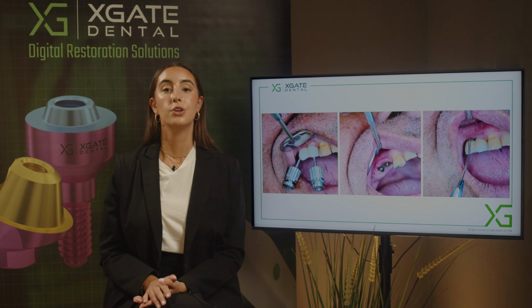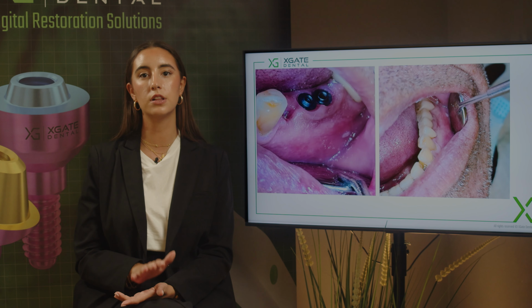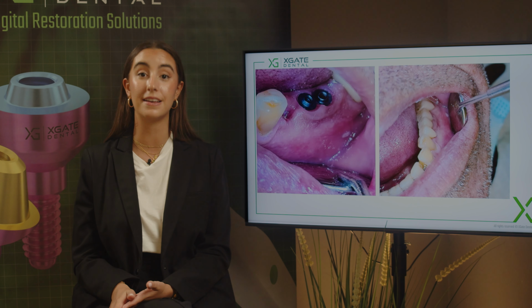You can see a little bit of the healing, and we have a bridge with one cantilever tooth and two screw channels. Because the screw channels are small, the whole screw channel fits in the occlusion part of the crown. You can see that they're not closed. The screw channels that were here also, we didn't want to use angulated multi-units because if you use angulated multi-units, almost half of the crown will be multi-unit itself. So you don't really have much of a choice here. You have buccal inclined implants and you need to make the best out of it.